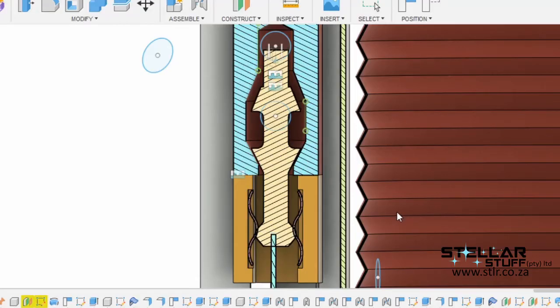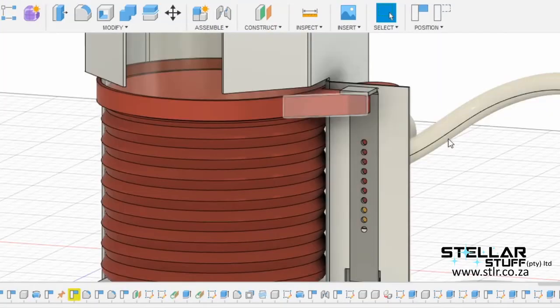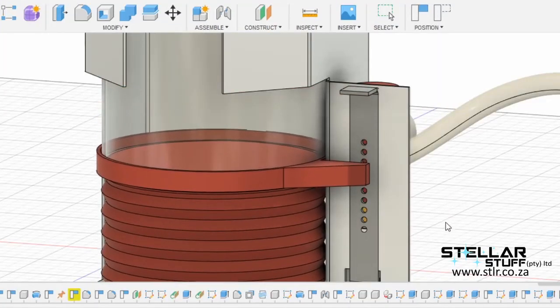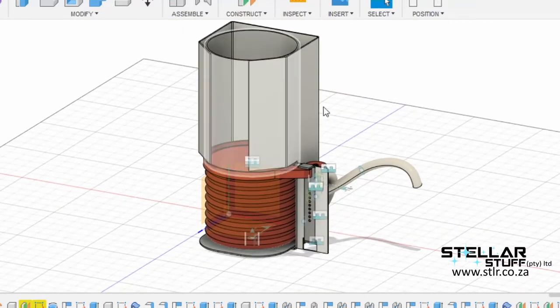The main working component of this design is this toggle valve mechanism. The tidal volume can be adjusted by placing a pin in the correct hole. By filling the PVC tube to the desired centimeters of water, the correct inspiratory pressure can be achieved.